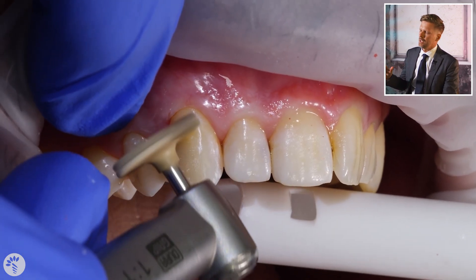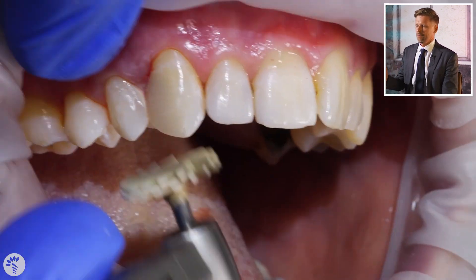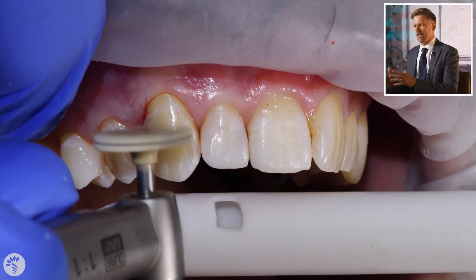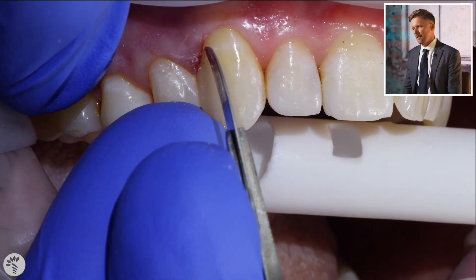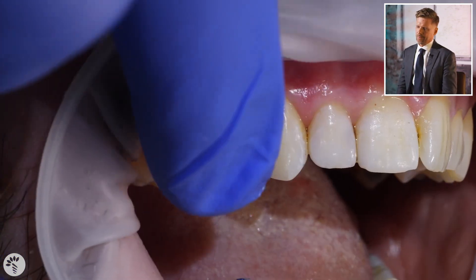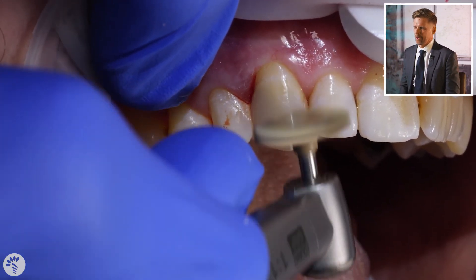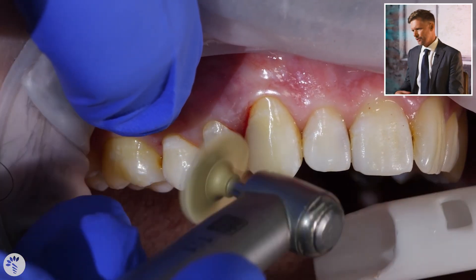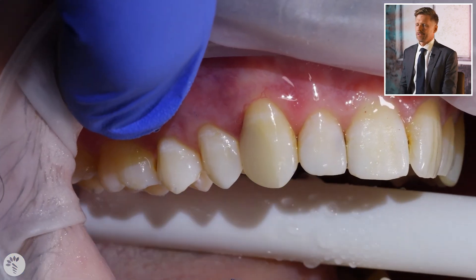When polishing and trying to keep the texture, you normally go through a sequence — starting with medium fine and then going to super fine. When preserving texture, you need to move from the medium-fine to the fine polisher quickly, leaving some texture on there and then just making it shiny. In this case we're leaving a little texture from that diamond bur, going briefly with the medium polisher just to take the edge off, then moving to the super-fine polisher before we've fully removed all of that texture — making all of that texture shiny.